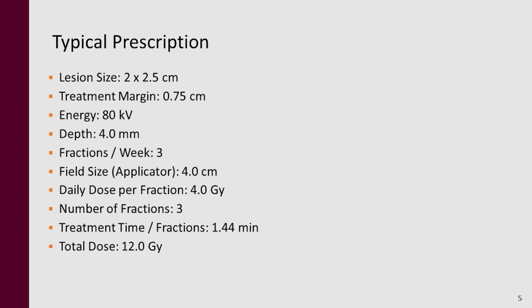This is what my typical prescription will look like. A radiation technologist will come in and do a simulation just like we always do. We try to get a margin all the way around the keloid if we possibly can. I use the SRT settings for this, even though with skin cancers I usually use EBT, but most of the data is with SRT, so I use SRT for keloids.